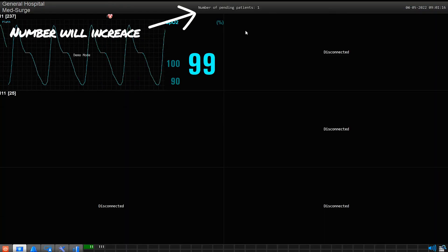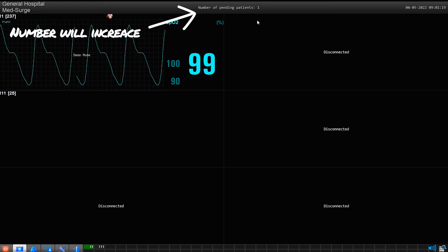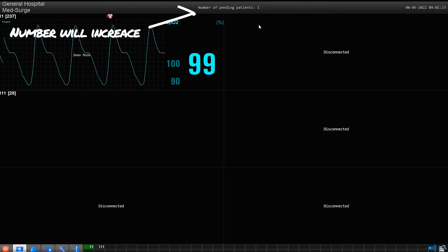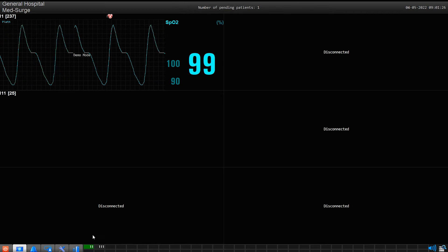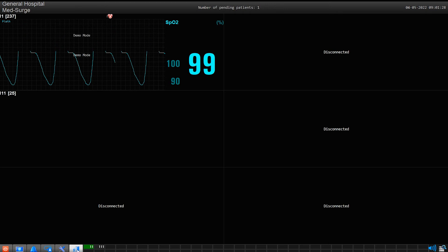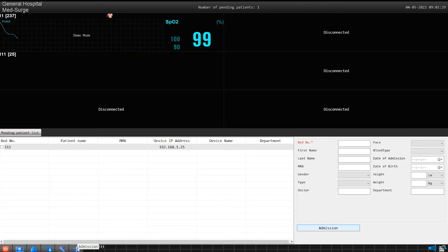When the transmitter connects, you will initially notice that the number of available transmitters will appear at the top middle of the screen. At this point, take your mouse and click on the admissions icon at the bottom of the screen. Clicking there will take you to this page.